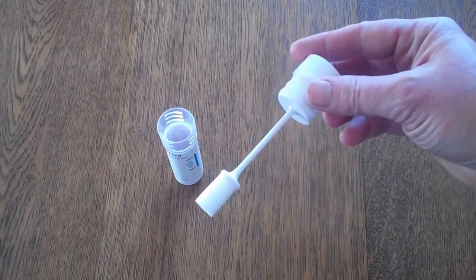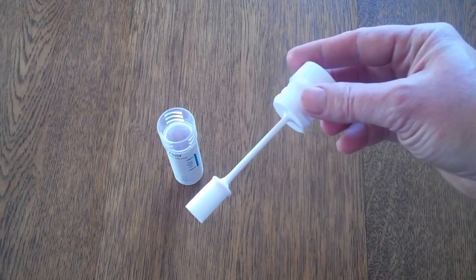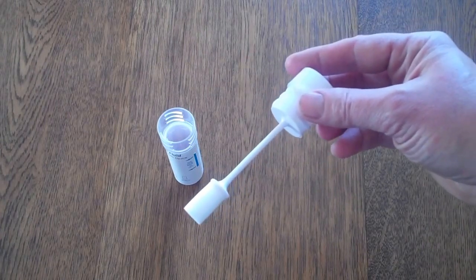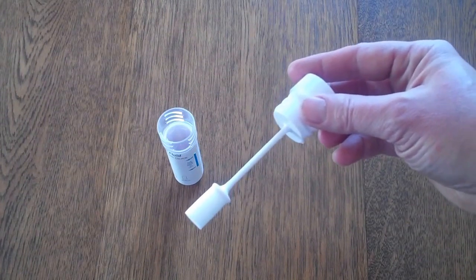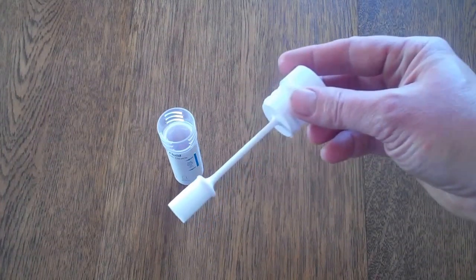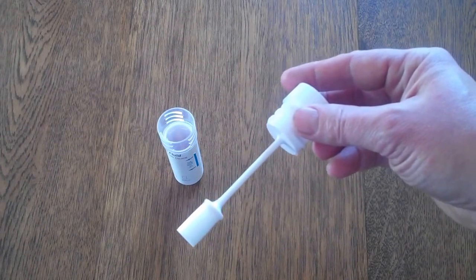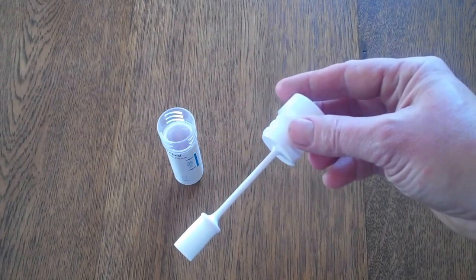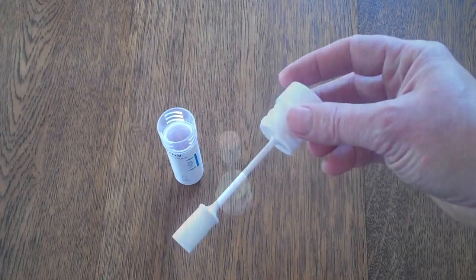If the swab is just swabbed around the mouth or cheek and then applied to the test, insufficient saliva will be absorbed and the test will not work. So what we're going to do now is give this to a donor to actually saturate the swab with saliva.